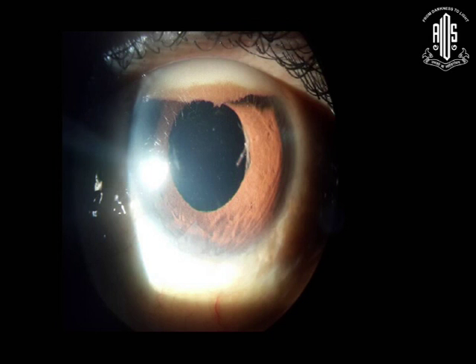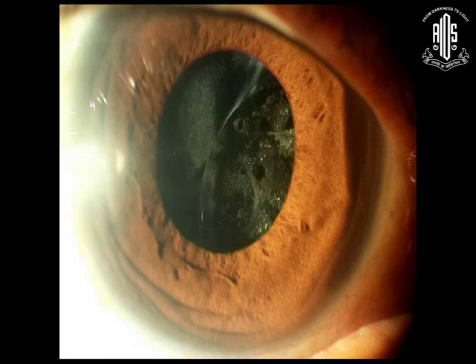So that is keeping the wound open, and there's a wound leak leading to hypotony and the sequelae of significant hypotony. This is hyperoleon or inverse hyperoleon, silicone oil globules. Some of them are covered with pigments. This is again a silicone oil filled eye with a subluxated lens. You can see the oil droplets on the lens.